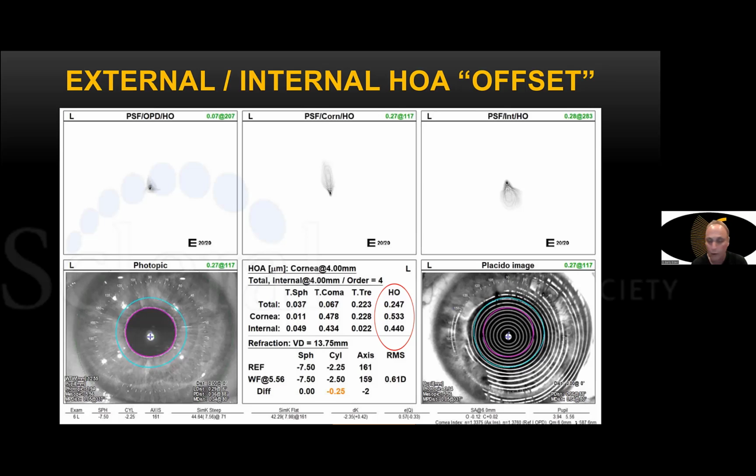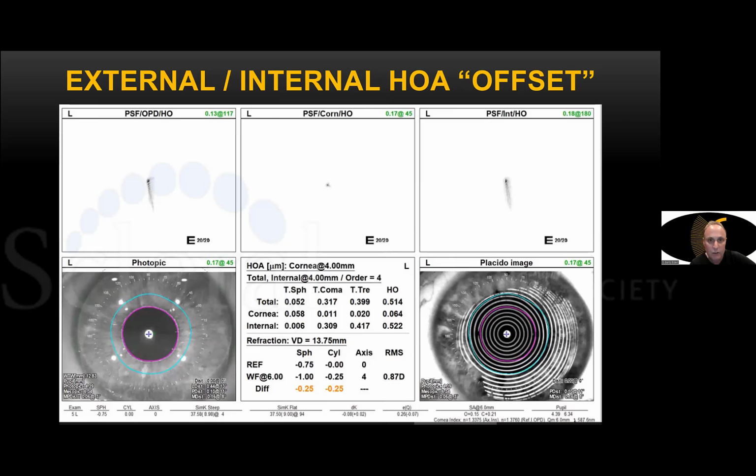And we look at the anterior corneal shape, whether you're doing placido topography or tomography, and you say, what? They've got keratoconus. How could they be doing so well? Well, there's offset. And you've got to be really careful about this, because you think you're being a hero in putting this rigid lens on their eye, whether it be a hybrid, corneal rigid, or a scleral, and they end up doing worse. There's a tremendous example.